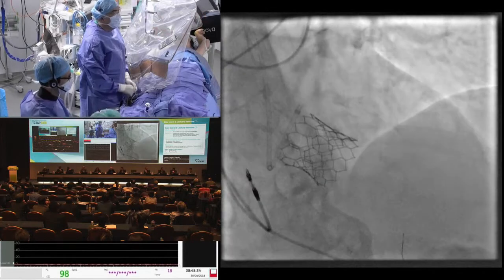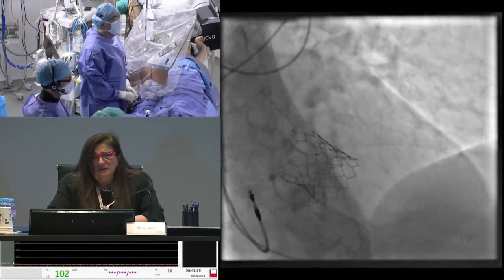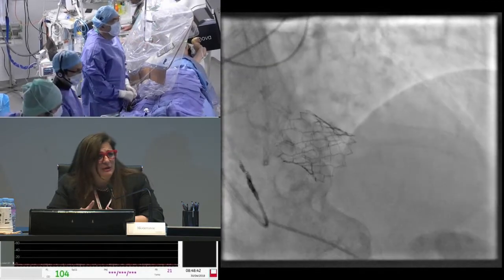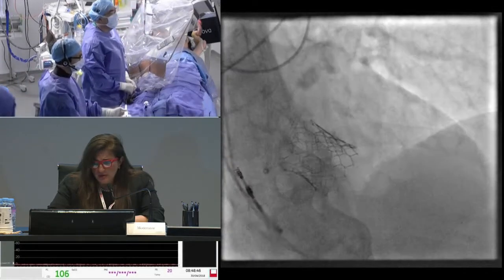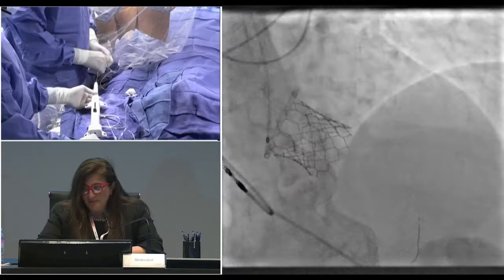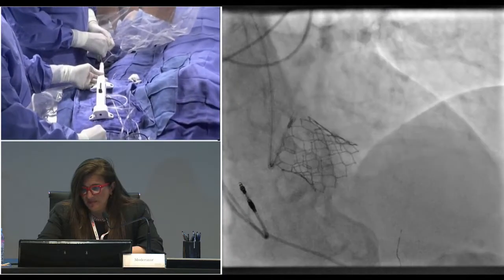No problem. But you know, you did a beautiful job handling the wire. Usually we don't do the bare wire in a case like that. We will come and use an introducer. But Jean Fajardet is a master, real master. Okay. Thank you for the master.